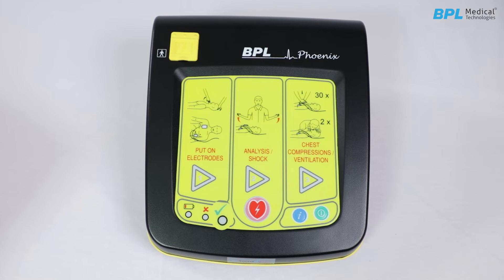Before switching on the DF2628, ensure that the OK status LED is blinking. After ensuring that the OK status is blinking, switch on the device by pressing the on/off key. The device will carry out a self-test to evaluate its status. After the self-test, only the OK status LED will light up to indicate that the device is fully functional and ready for use. The low battery indicator should be off. Voice prompt delivery starts immediately after the self-test completes.